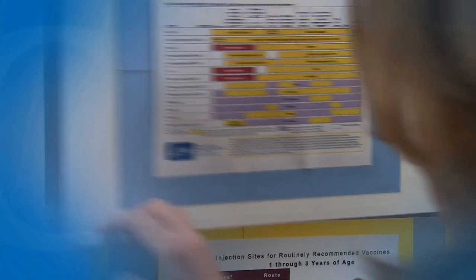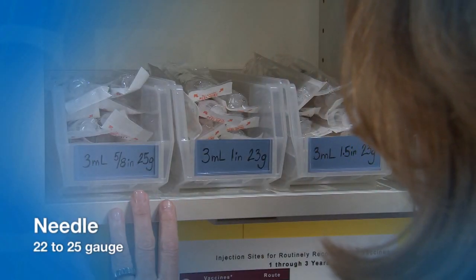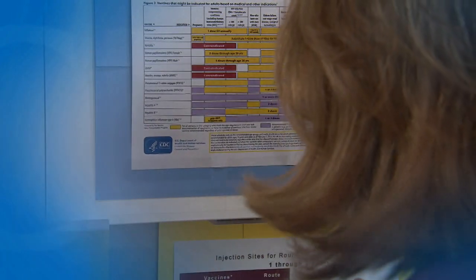A one or three milliliter syringe is used to administer an I-M injection. Typically, vaccines are not a thick liquid, so a 22 to 25 gauge needle is used. The appropriate needle length can vary. A supply of needles in lengths appropriate for the patient population should be available.